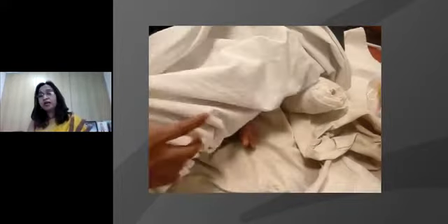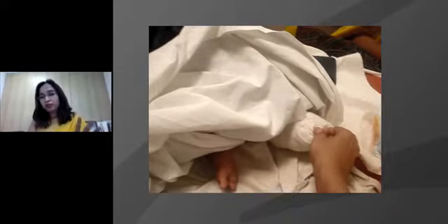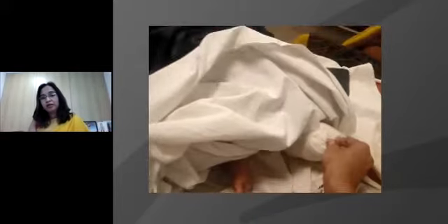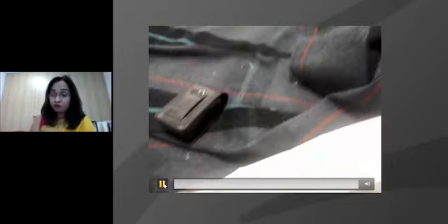So what I do is I put a gentle pinch on the leg which is operated and blocked, and the suckling goes on. And I gently pinch the other leg. Well, so the story is telling itself to you.